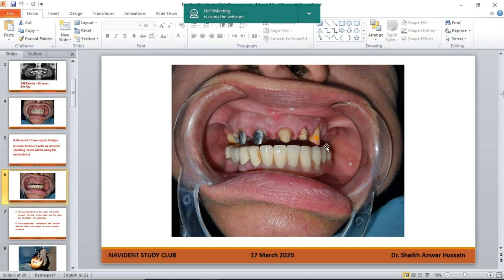You can. So I wanted to use this canine to attach the jaw tracker. The reason being that there were none of the other teeth I could really use with composite to get a good jaw tracker fixation. So I used this dispensable tooth. I made a hole in the tooth after anesthesia, of course, and bonded the jaw tracker there. And I got an excellent passive fit for the jaw tracker, which was absolutely stable for further tracing, etc.